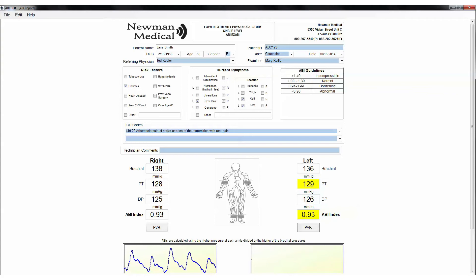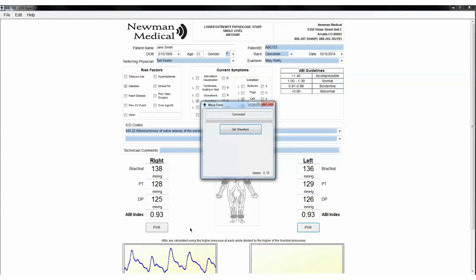Release the pressure in the cuff and prepare to take a PVR waveform. Obtain a PVR waveform at this ankle cuff in the same manner as before. Click on left PVR. Inflate the cuff to 80 mm. Deflate to 65 mm and press the Get waveform button.